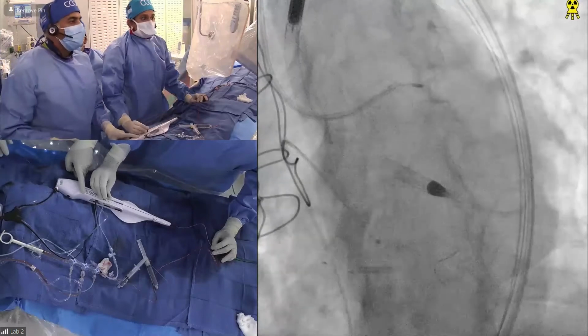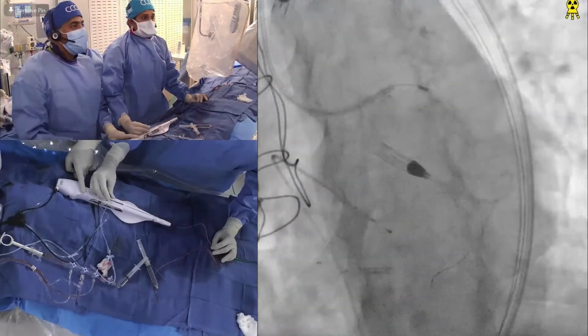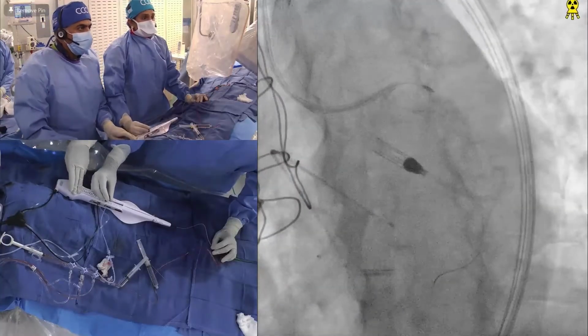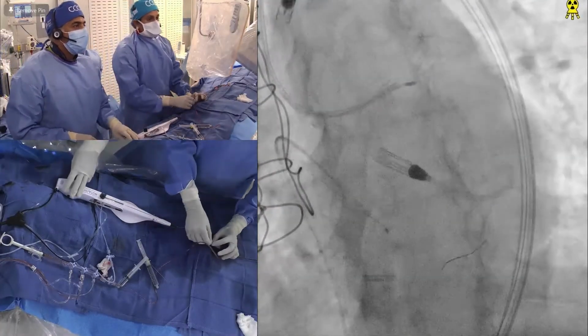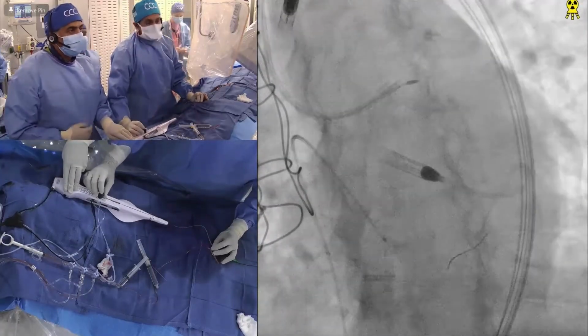So the Turnpike LP is what Dr. O'Neill was talking about as one of the go-tos. Okay, so let's see how you're going to do this. This could also get stuck in the calcium, especially the 1.25 burr, right? So let's see.